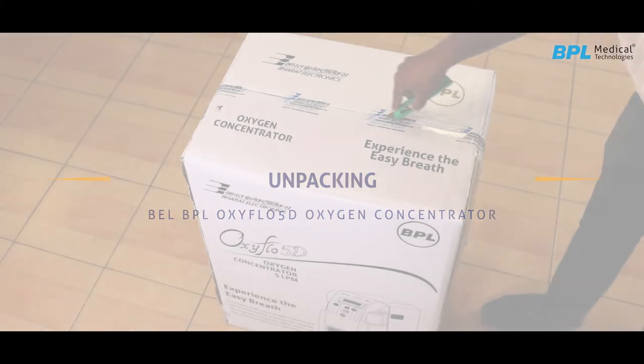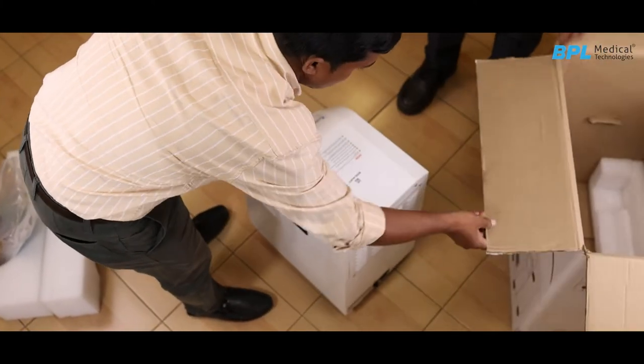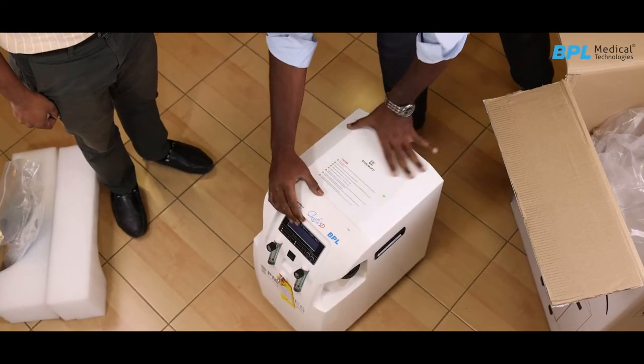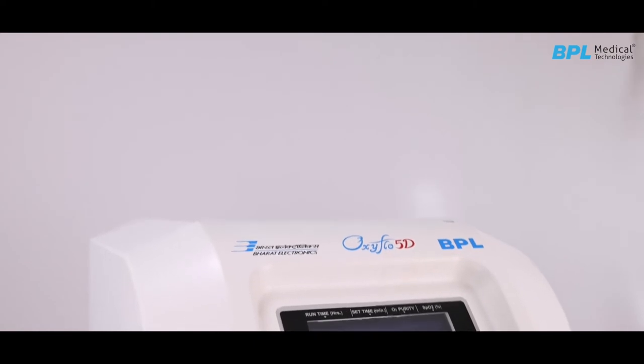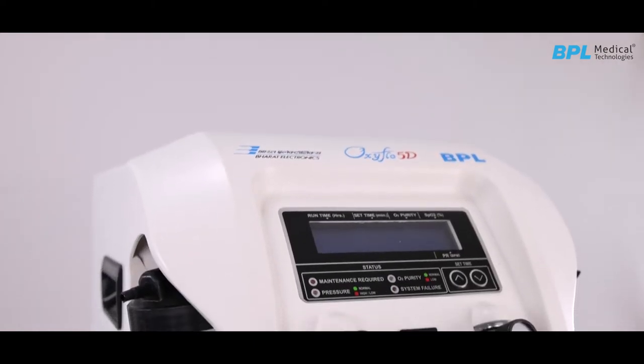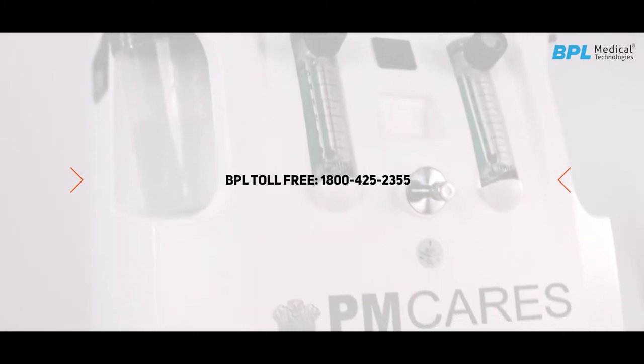Unpacking the Oxygen Concentrator: carefully take out the oxygen concentrator and all other items from the carton. Check for any physical damage to the oxygen concentrator. If damage is evident, please notify the BEL-BPL call center via toll-free number 1-800-425-2355.